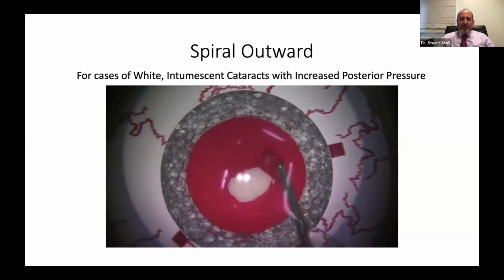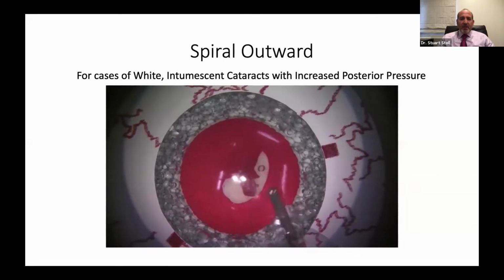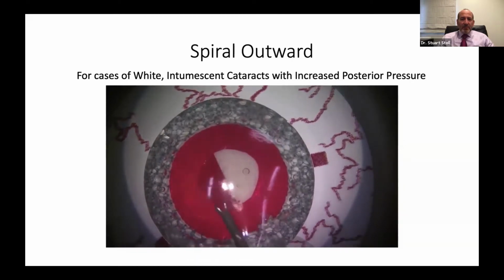CataractCoach.com has some great teaching tips on that. But here we are. You can see that we're getting continuously bigger as we go. Immense control, capsule flipped over, tension on. And we're just going to get bigger and bigger as we go here.